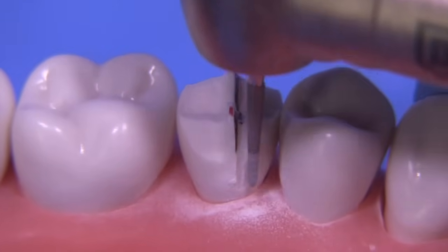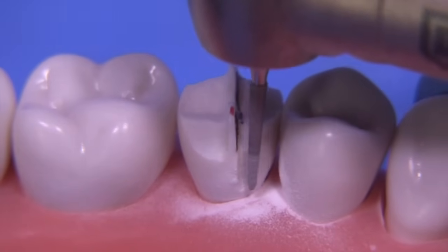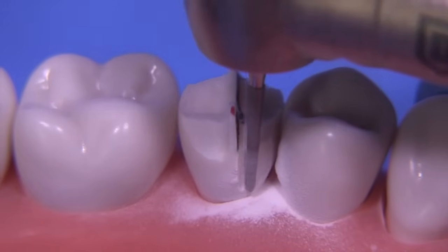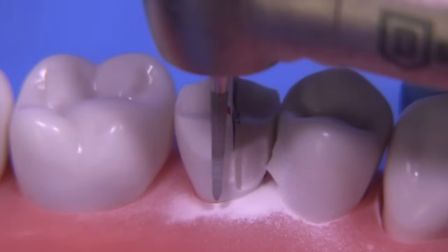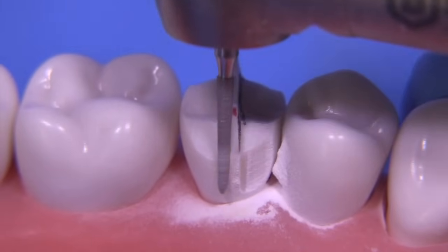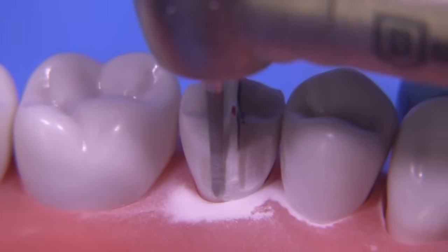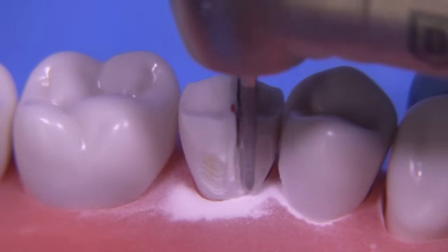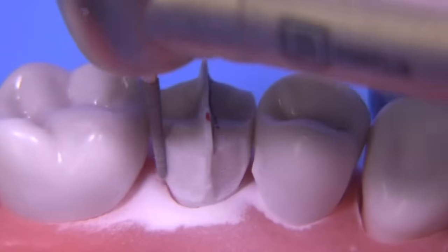This is the 878K 012 and this will be used for the lingual axial reduction. We're using this smaller diamond because this area is going to be metal — porcelain fused to metal — not just porcelain all the way down to the gingival. We'll probably have a metal collar on this preparation anywhere from one to three millimeters in dimension. One of the nice things about the 878K is it's great for creating taper.